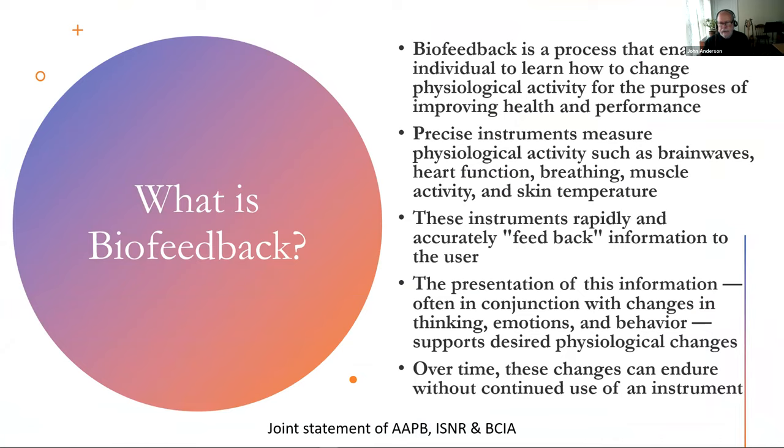And it's not a treatment, it's training. There's no input into the client. It's simply feeding back information to the client that then they can make use of. And we encourage them to move in the desired direction towards greater health. And we'll talk about how we determine that a little bit later.